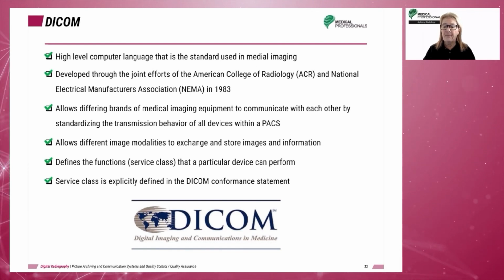In 1983, the American College of Radiology and the National Electrical Manufacturers Association, or NEMA, joined together in an effort to establish a standardized public format and protocol for communication between all biomedical imaging files, according to Carlton and Adler. DICOM was first introduced in 1985 and became the standard in 1993.